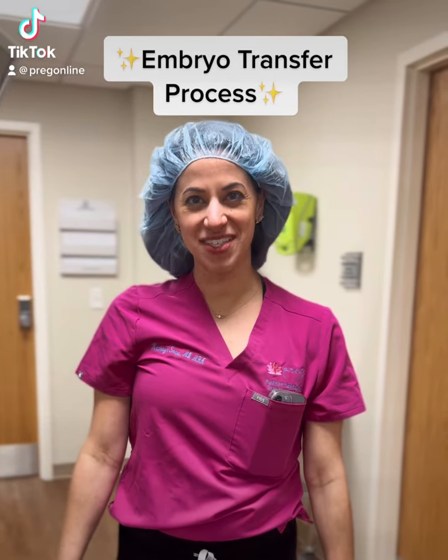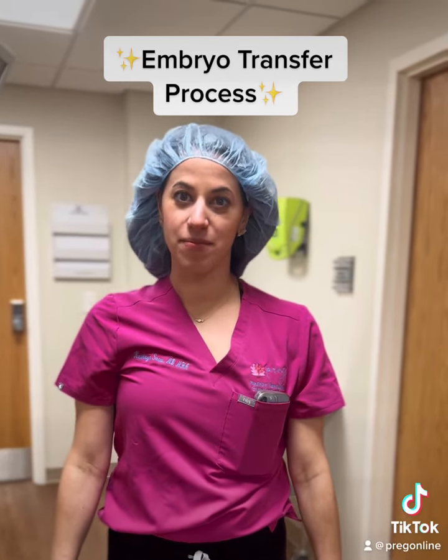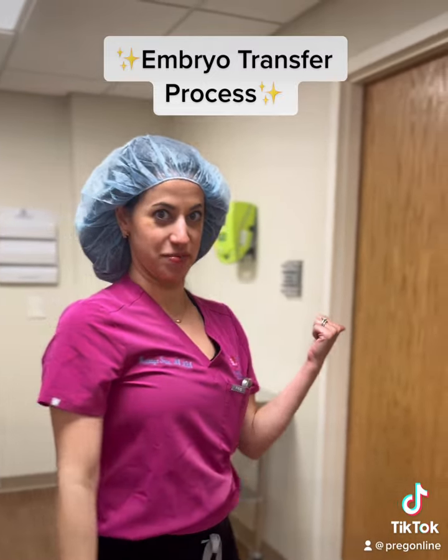Hi, I'm Dr. Catherine Snow, and let's go through the steps of an embryo transfer. Let's head to the procedure room.